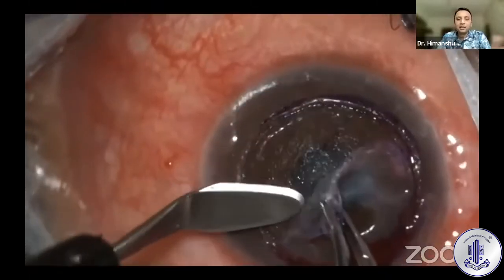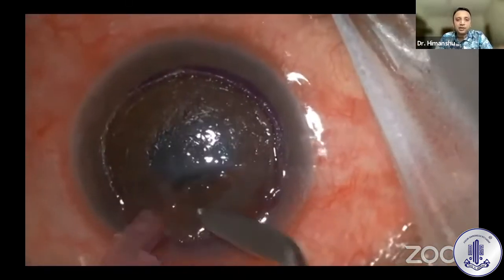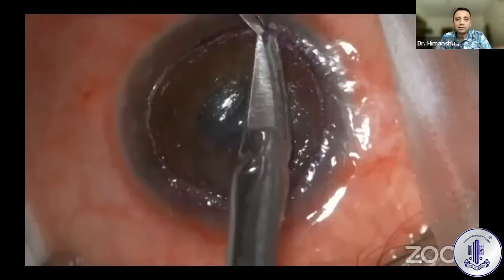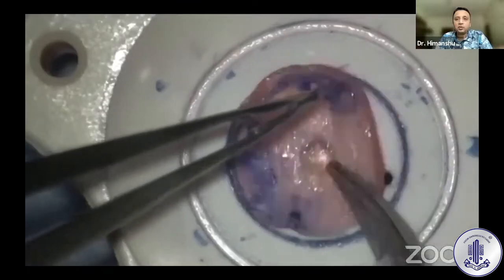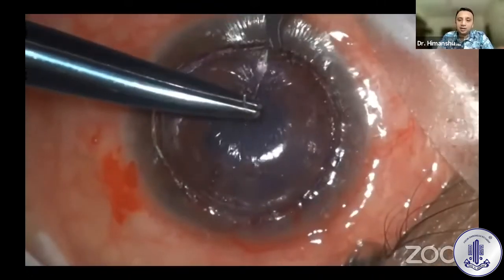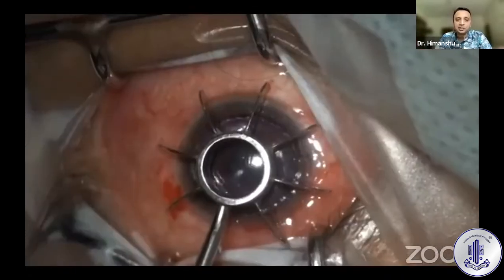certainly embarrassing. We start dissection from the periphery, come towards the perforation area at the last, and make sure we do not disturb that area as much as possible. Try to deepen the cornea in the periphery, try to make a pocket here so that you can tuck in the tissue. From the donor tissue, you can reduce the peripheral thickness so that it does not stand up too much, because you have not dissected the entire cornea there. And then once you take the suture, preferably take the size of the donor almost similar to the recipient size.